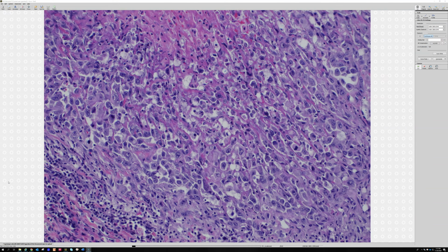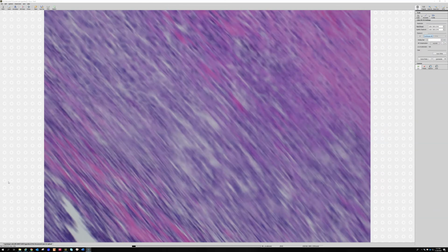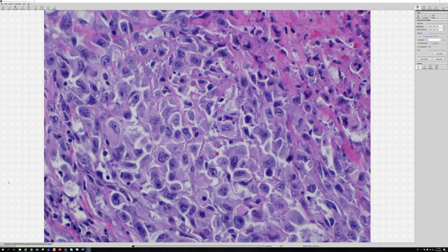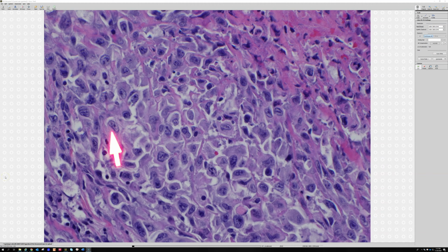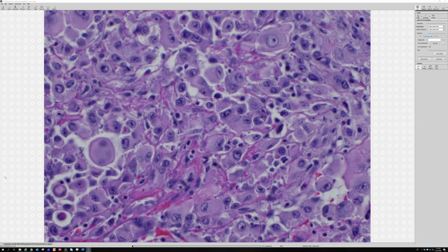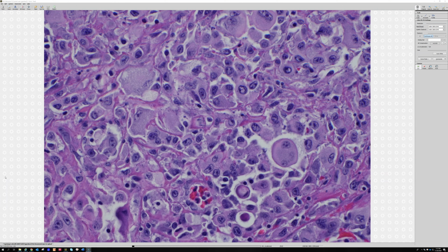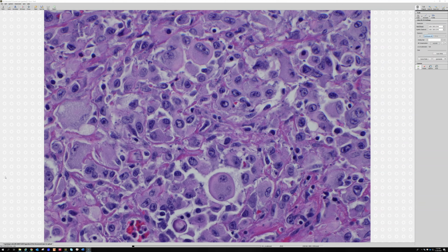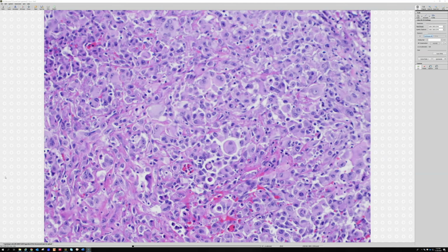They are huge cells, and they all have mitoses. They're really big and atypical. They tend to have this kind of pale, cleared out chromatin, sometimes very pale vesicular looking chromatin, kind of a grayish color. The cytoplasm is usually dense pink because they are filled with keratin filaments. So they look epithelioid and they stain with keratin because they're filled with keratin filaments. They almost have that hard cytoplasm that you see in a squamous cell carcinoma. Cytologically, sometimes they have some resemblance to squamous cell carcinoma to my eye.